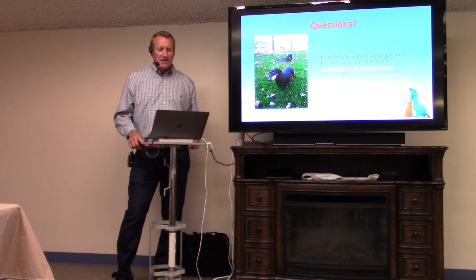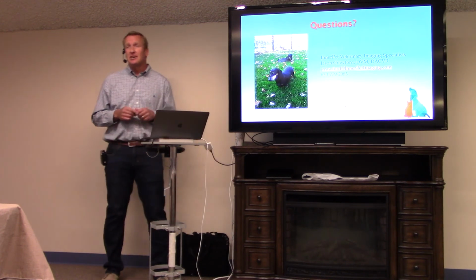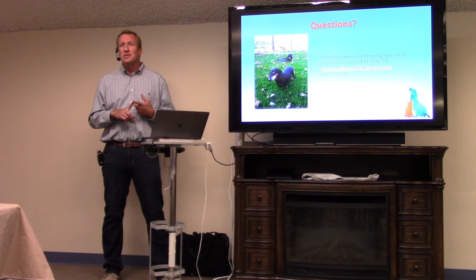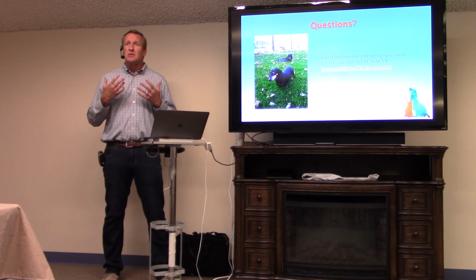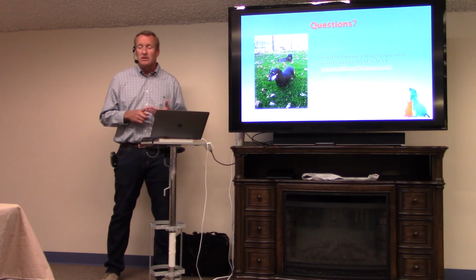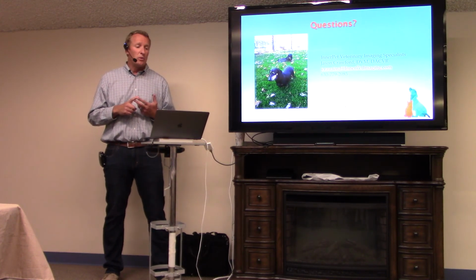Sure, I think that's a reasonable question, and yeah, I have seen an increased acceptance and an increased number of studies being done. When I was a resident at University of Wisconsin, we had a CT machine there. I think probably 3/4 of the studies were either just doing heads or backs, but as we see this evening, there's a lot of other things that can be done with CT.